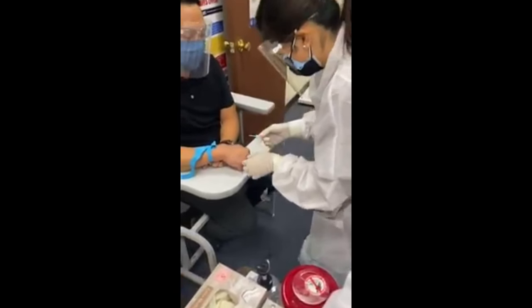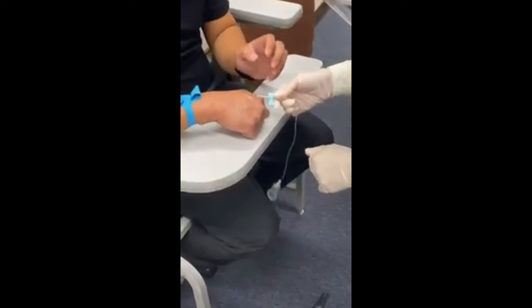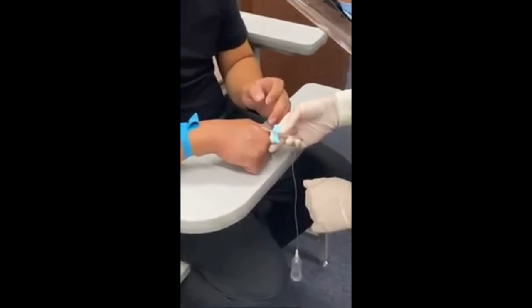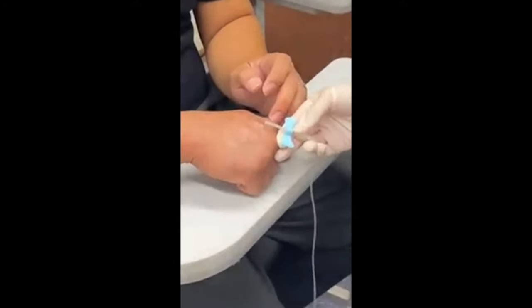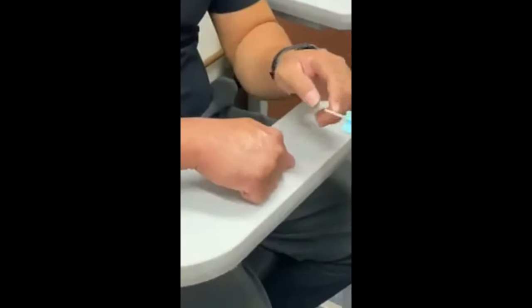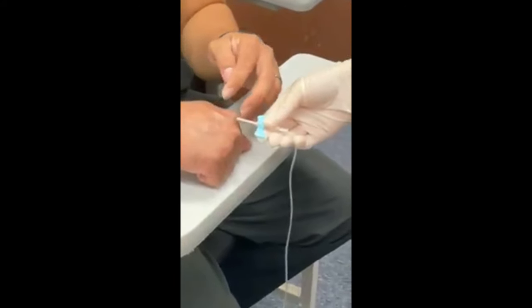Okay. So how would you stick? Oh, I touched it. No, it's fine. So just stick a little bit lower. Okay, so with this one, it's kind of tricky as far as it's close to... Yeah. So try. How would you position your hand so you have control of it? So you're still supporting from here, but at the same time sticking from here.